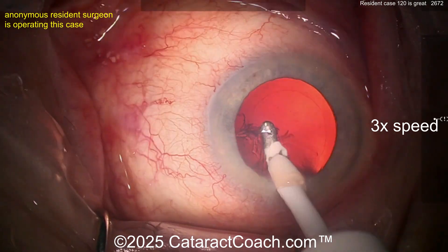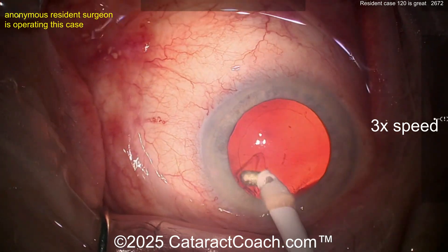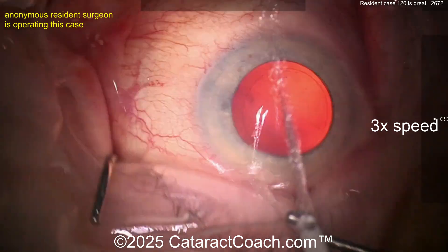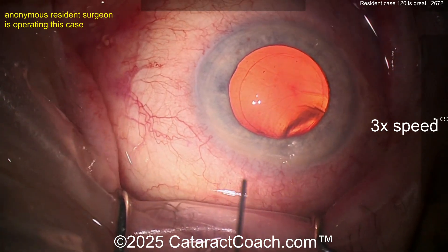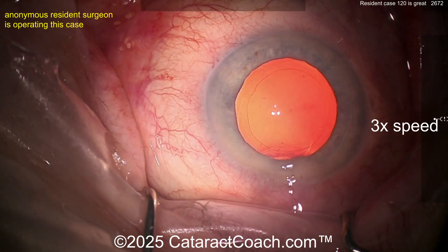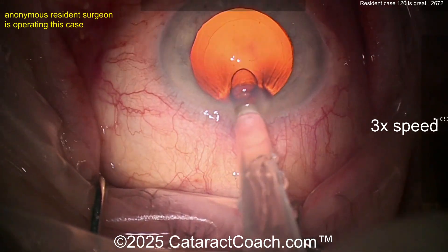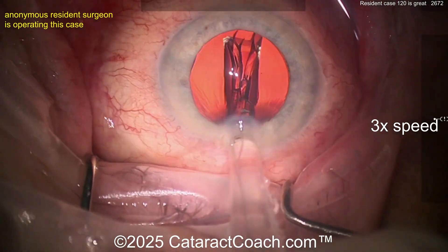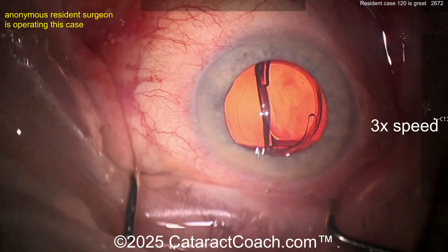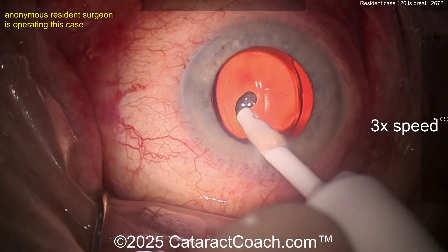I use the coaxial because I'm used to it, I like it, and I don't have to make an extra incision. Sometimes people have an easier time accessing the sub-incisional area with bimanual. Now that looks like a beautiful rhexis by the way. Here comes some viscoelastic to fill up the capsule bag, and let's see the lens going in — here comes the lens. Looks like a single-piece acrylic lens — get that delivered into the capsule bag.